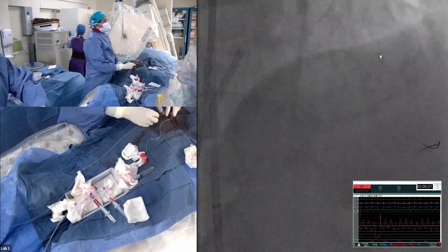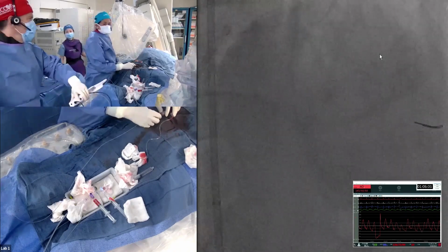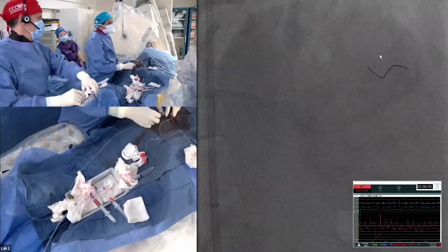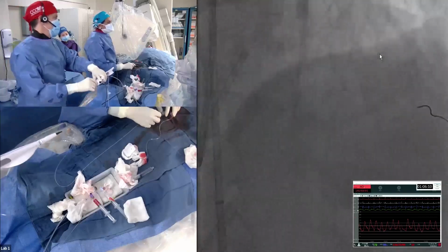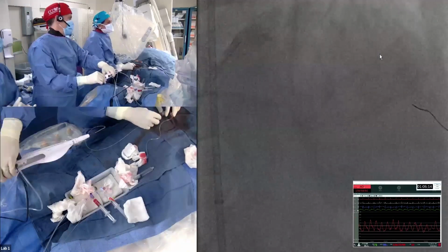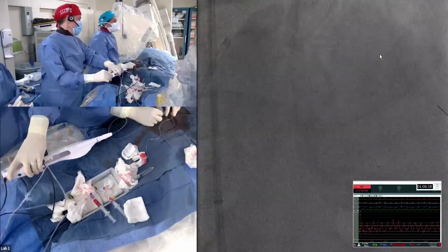Okay. So obviously, we've emphasized calcified nodules on other cases, which goes to tell you that they're difficult to deal with. Okay, enough. Okay, good. Do you want to see how the flow is in the wire? Right now, quickly finish the diagonal. That's it. I think we're okay.